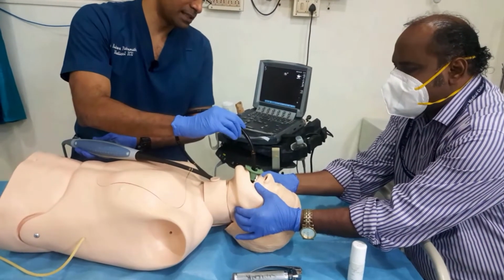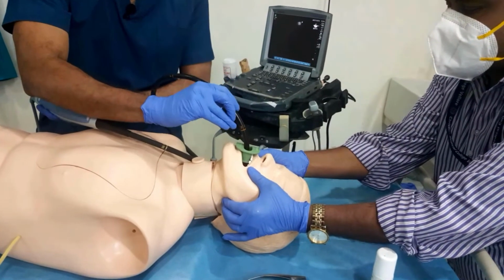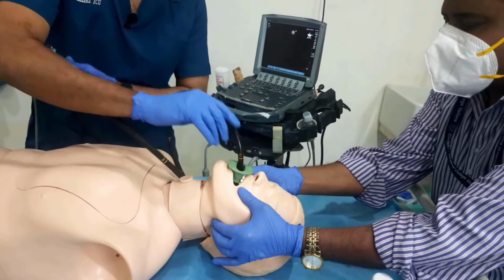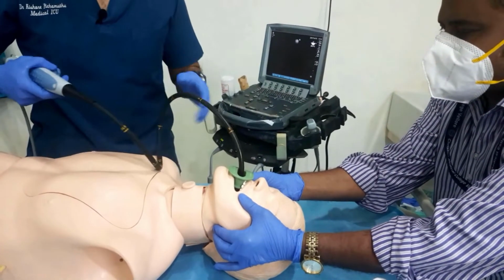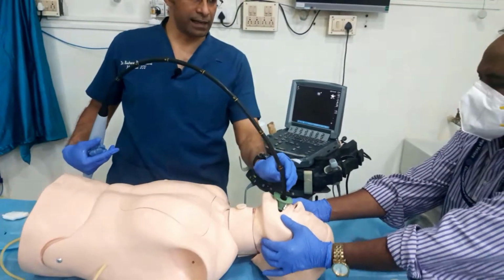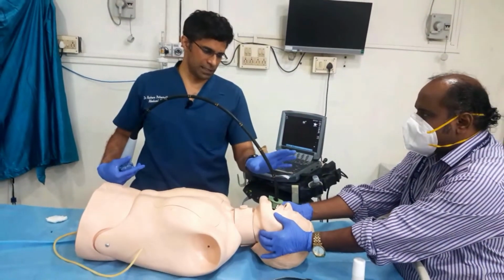You may find some resistance around 15 centimeters at the upper esophageal sphincter, and once you get beyond that, it starts moving in smoothly. So if you're not able to get it with this technique, you may have to use a laryngoscope to guide it into the esophagus.